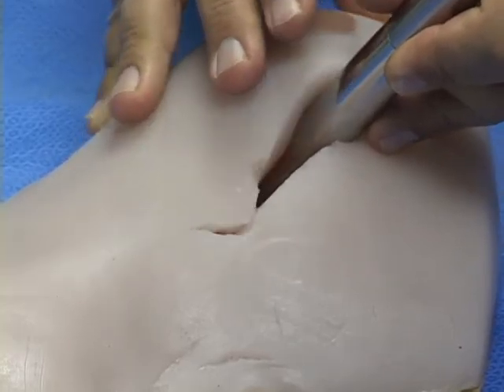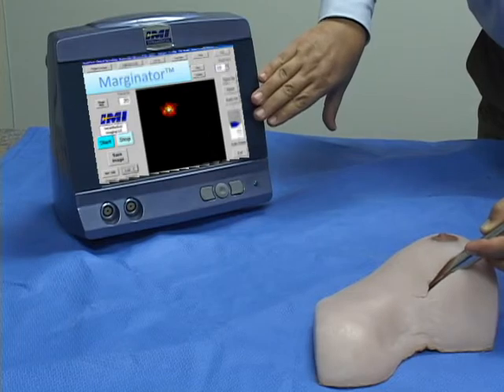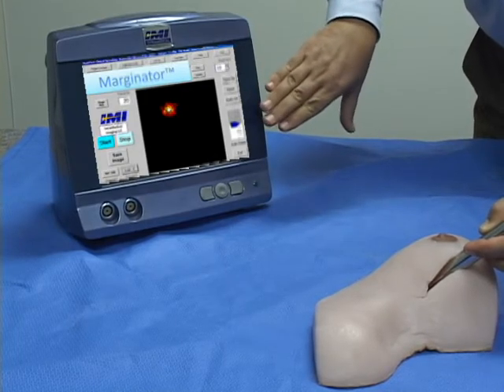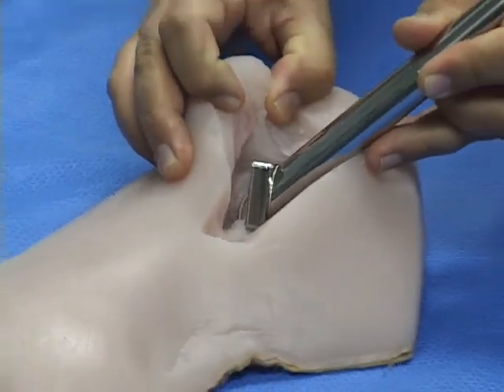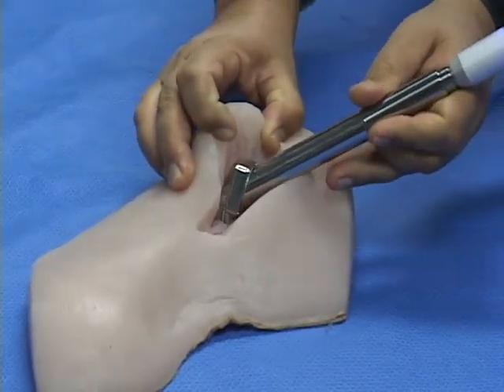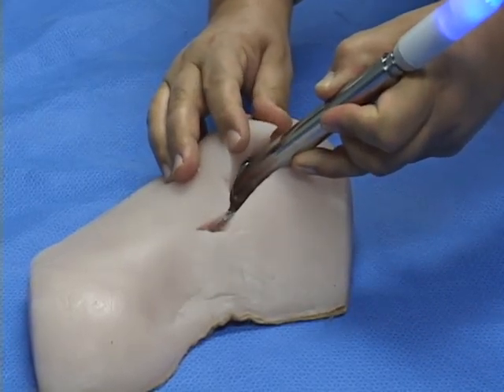After 10 seconds, an image of the radioactivity appears on the screen. This image indicates a single focal point of radioactivity and tells the surgeon where he must remove more tissue. After that procedure, the surgeon presses a button on a foot switch to clear the collected image on the screen and the target area in the patient is checked again.